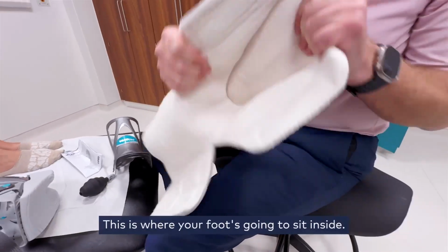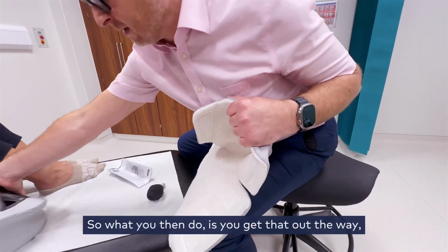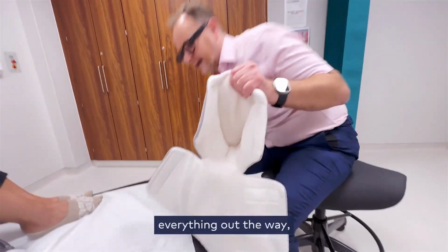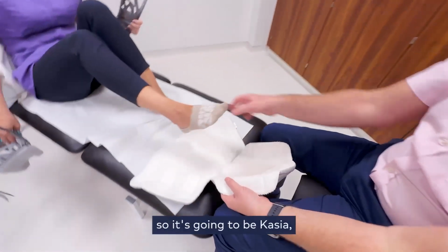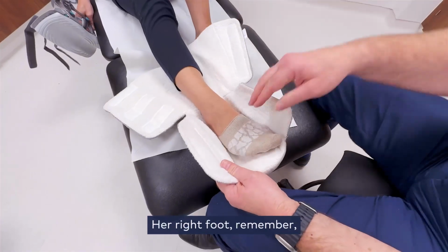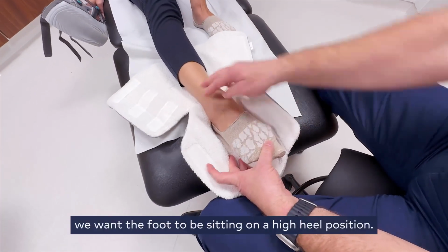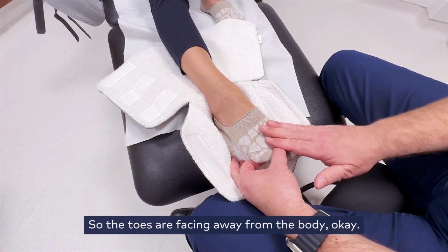This is where your foot's going to sit inside. So what you then do is you get everything out of the way, and you ask the patient to put their leg inside. Cassia, one of our senior nurses, is going to demonstrate it, her right foot. Remember, we want the foot to be sitting in a high heel position, so the toes are facing away from the body.